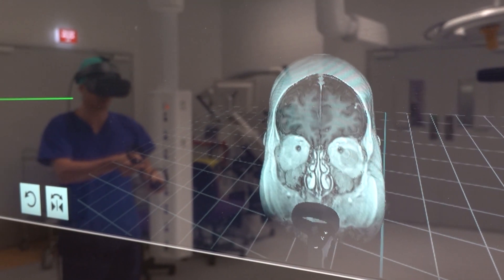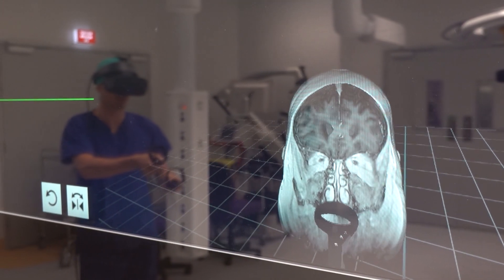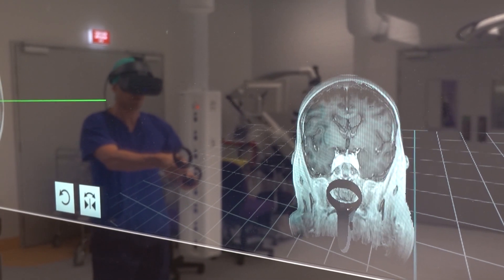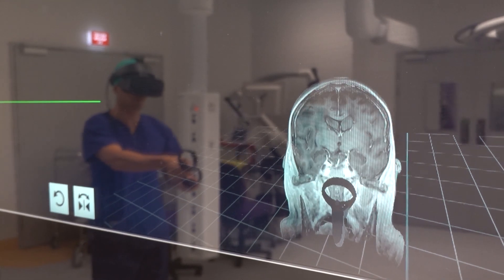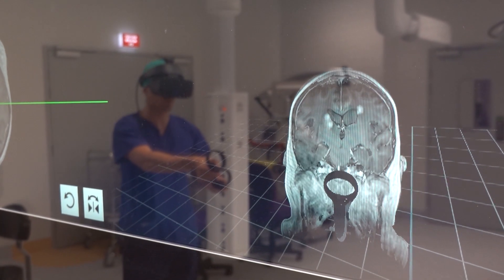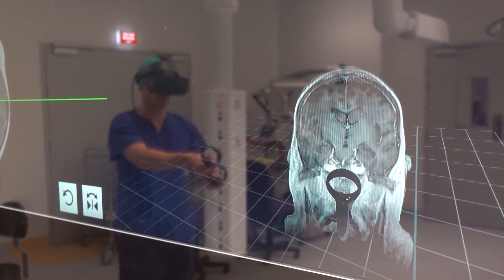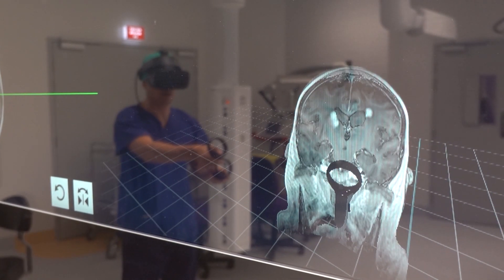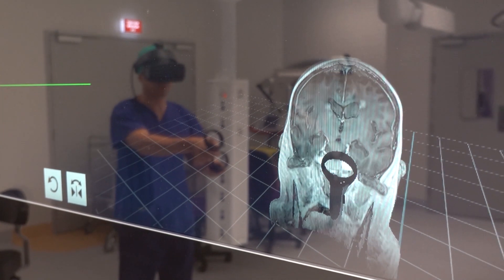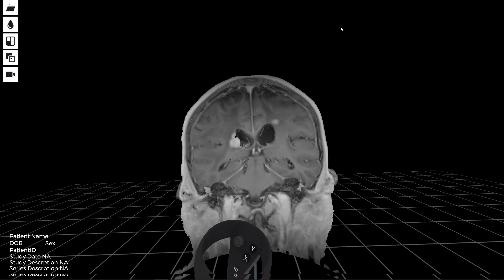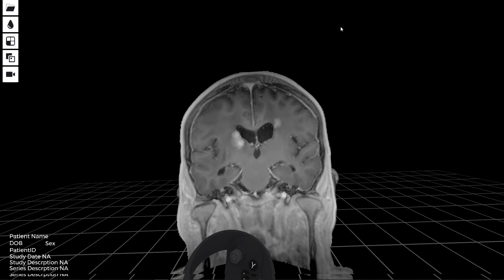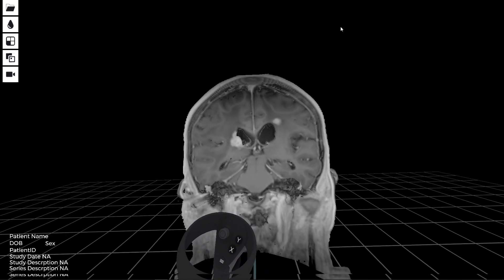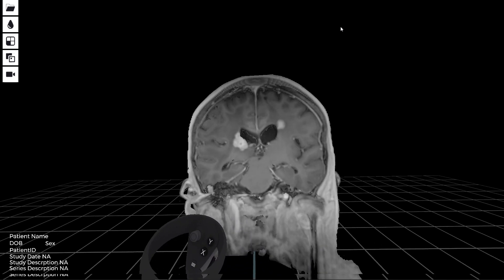Here again I can see the ventricles and the lesions that are deeply seated near the ventricles. For example, if I plan to do a biopsy I can make sure that my biopsy needle will not go through the ventricle or go through the sulcus that contains the vessels.